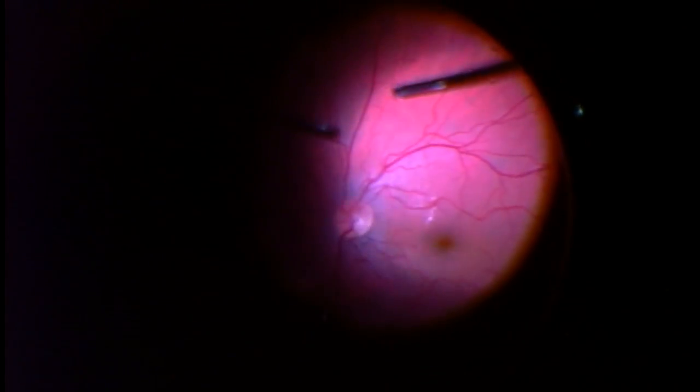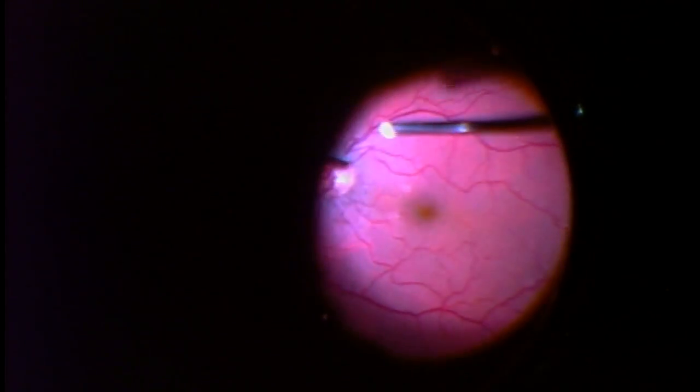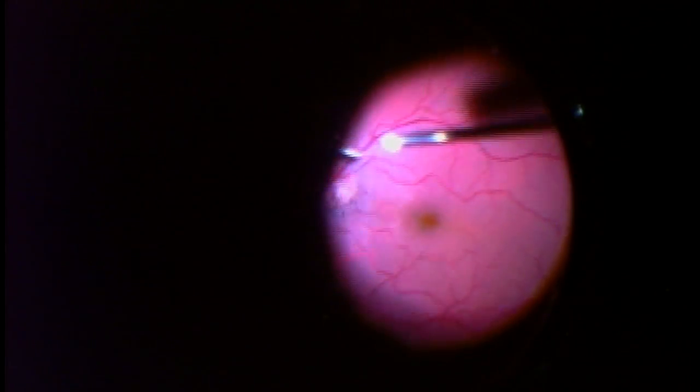The first step during a vitrectomy is to remove the core or central vitreous. This is a patient who has not yet had a PVD. A PVD, by the way, is a naturally occurring event — that is, it should happen to everybody at some point in their life.